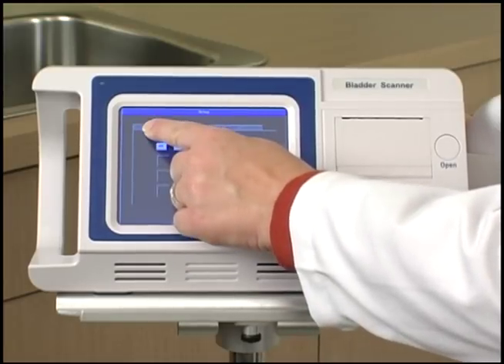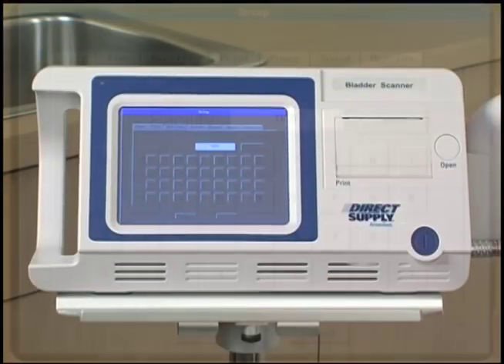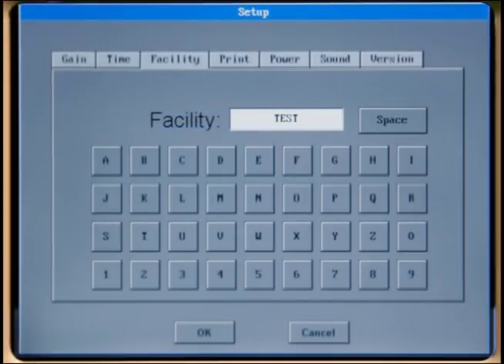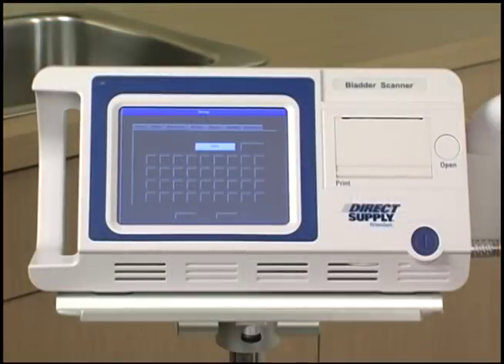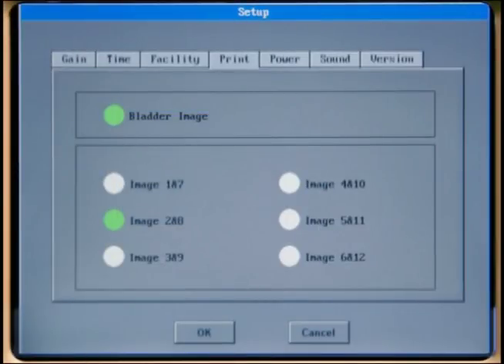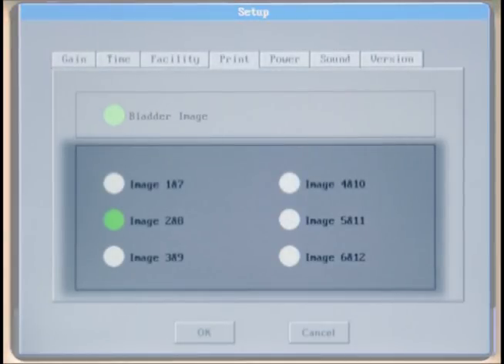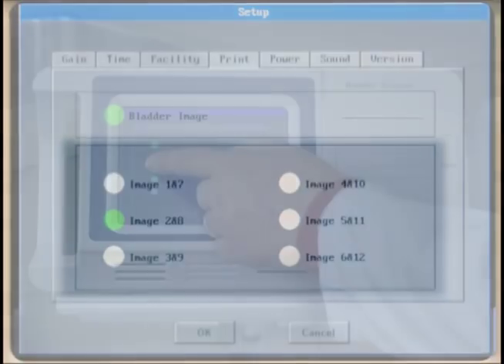The time menu lets you adjust the date and time displayed on printouts and system records. The facility menu lets you add your facility's name to the printout record. The print menu lets you select what information to include in the record printout. The print submenu is separated into two zones: the upper zone selects or deselects the bladder projection image for printing, and the lower zone allows you to select a cross-sectional image to add to the printout.